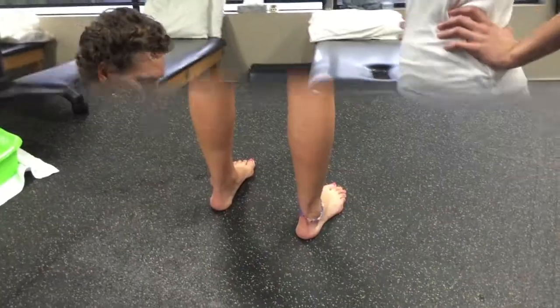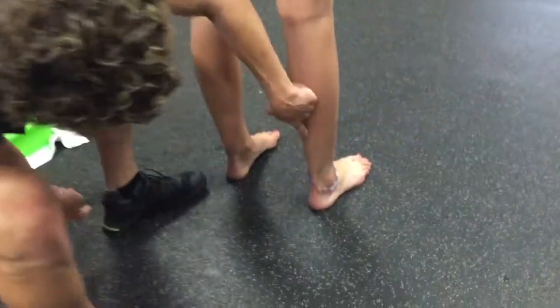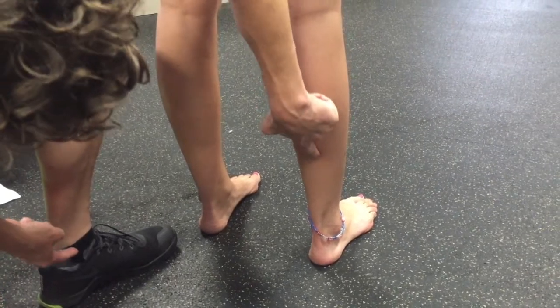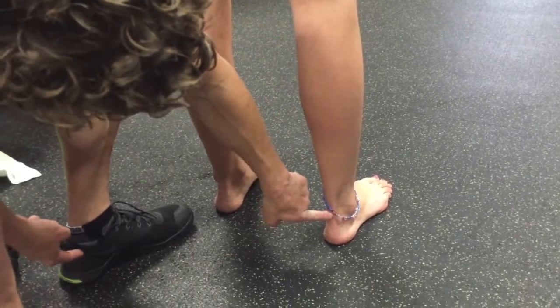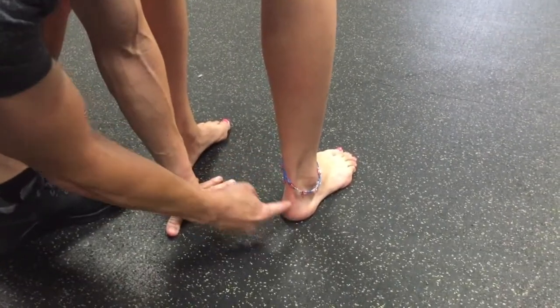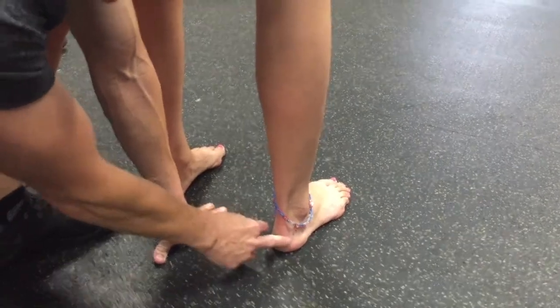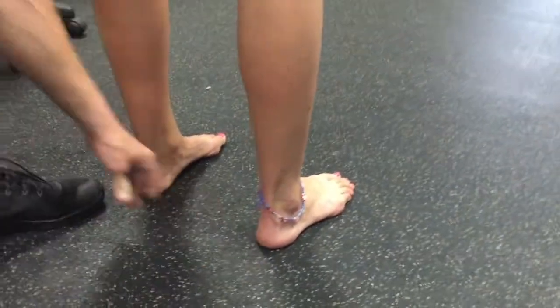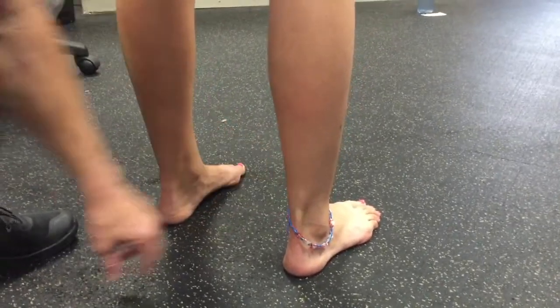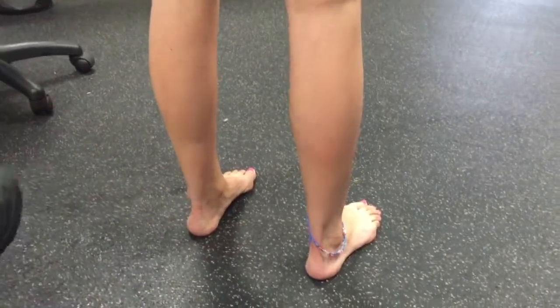Now we're looking at the rear foot position from behind. We're looking for alignment between the middle of the calf line at the Achilles tendon and then the heel. You'll see this angle — that angle is what we call an everted position, which means the heel is collapsed. It happens on both feet, but seems to be a little more on the right foot.